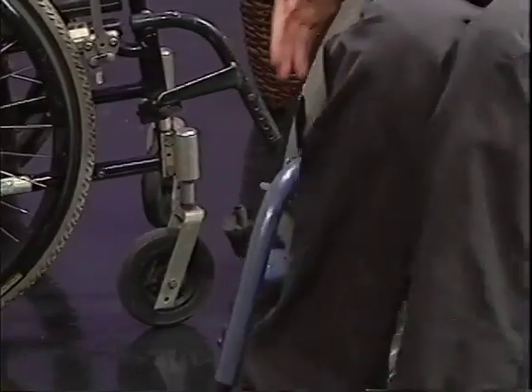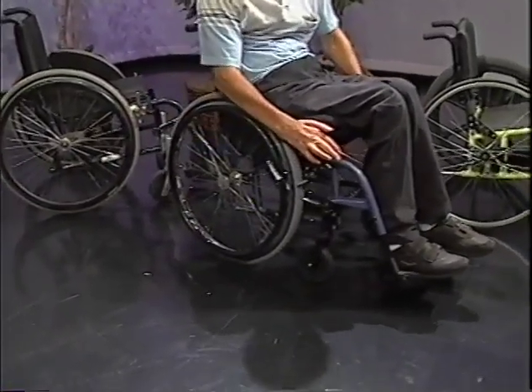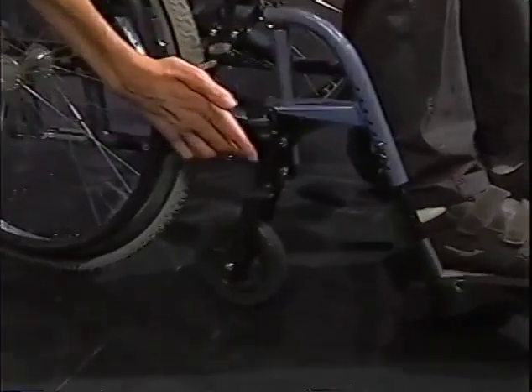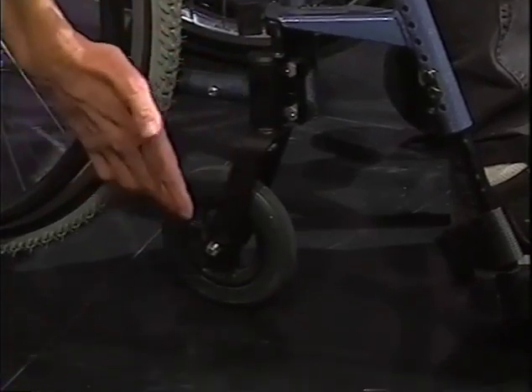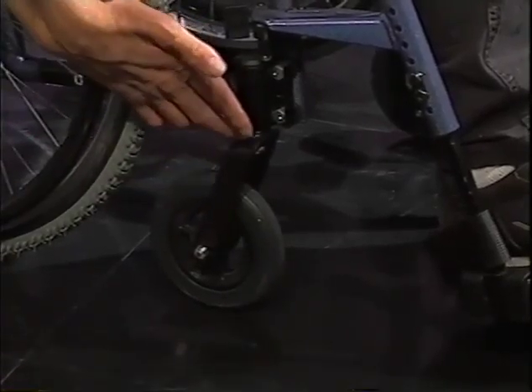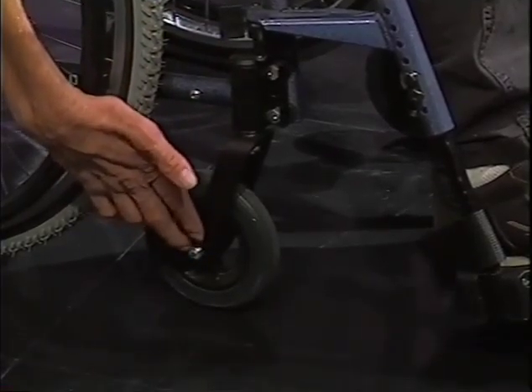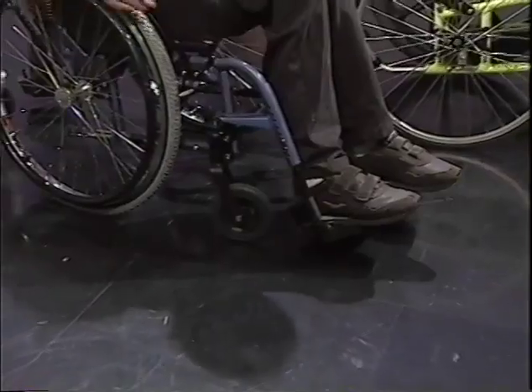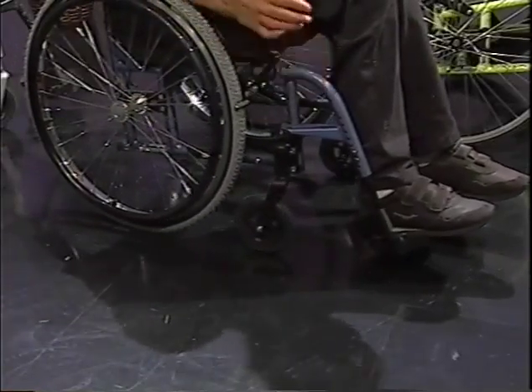This chair that I'm sitting in, my brand new chair, which I recently got, the front end is incorrect. The distributor was supposed to bring it with the 1.5-inch fork extender and the same fork. This piece of the fork, the blade, is the same as the other chair you just looked at, but there's no spacer in here, and the wheel is mounted back here for a further sweep. The problem with this chair was it was hitting my heel loops, and so the distributor thought, well, I'll just put the left side on the right side and correct the problem, which is not what we agreed to when we bought this chair.